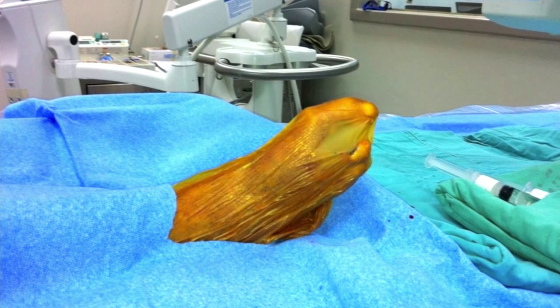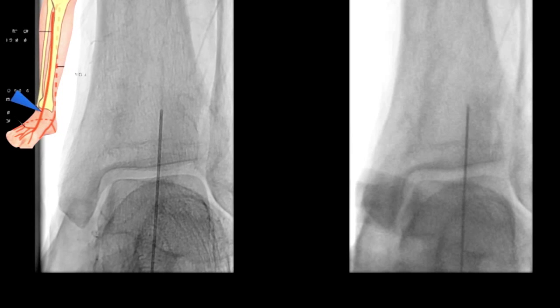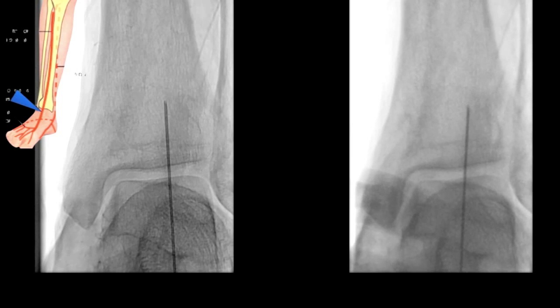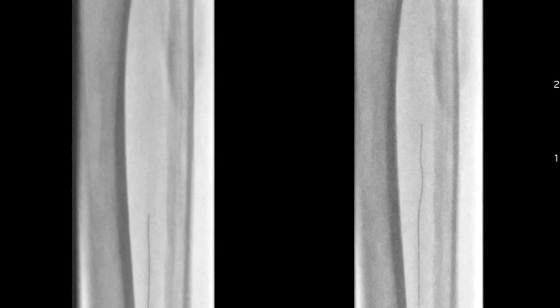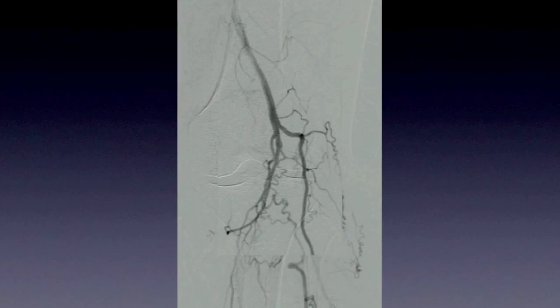Once prepped and draped, you're going to numb up the skin and start. This just exemplifies how the medial calcinosis is even hard to beat with a needle — that dorsalis pedis wiggles around as you're trying to poke it. But once you get the wire in, then you slowly traverse in a retrograde fashion. It is ideal to always use a catheter, microcatheter, or micro balloon to support it. That allows you to do the angioplasty and get flow down and have adequate perfusion of the anterior aspect of the foot, as in this case that allowed us to do an adequate TMA.